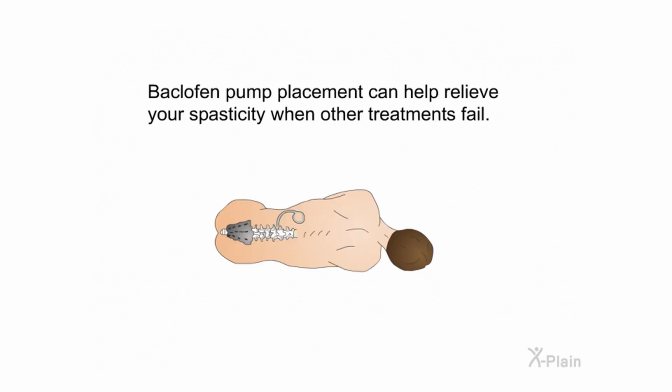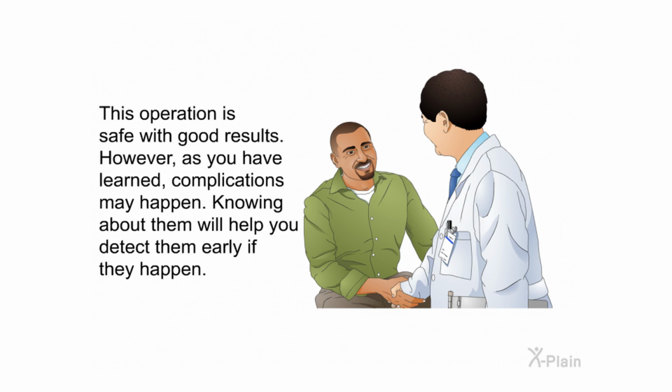Summary. Baclofen pump placement can help relieve your spasticity when other treatments fail. This operation is safe with good results. However, as you have learned, complications may happen. Knowing about them will help you detect them early if they happen.